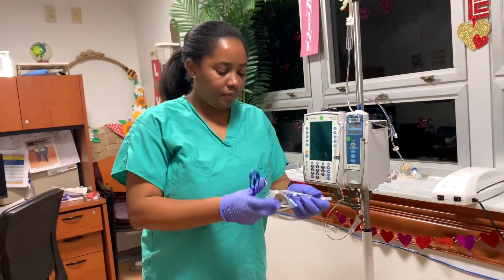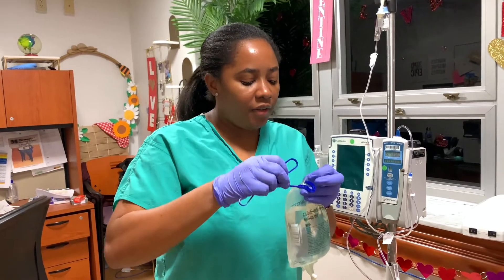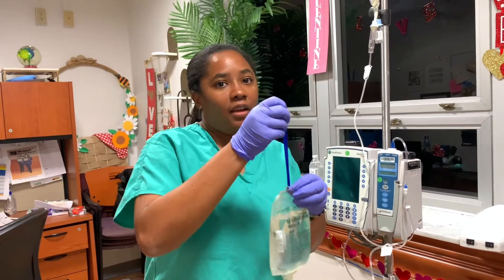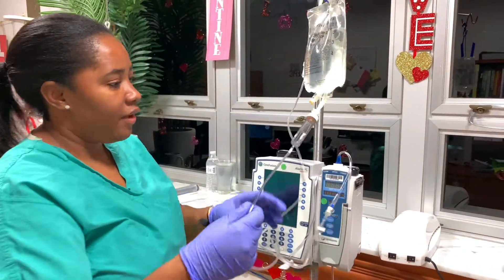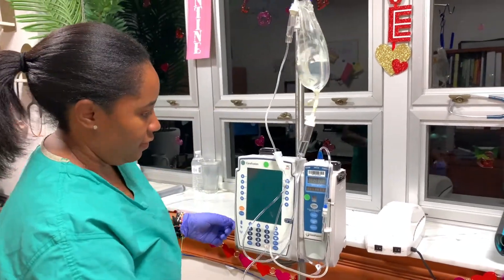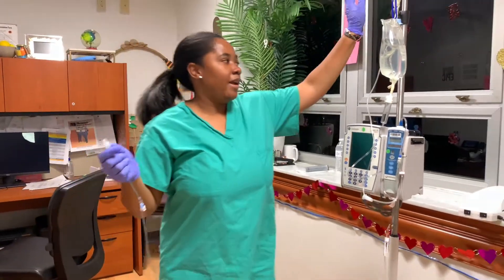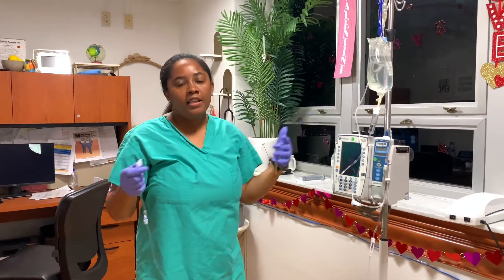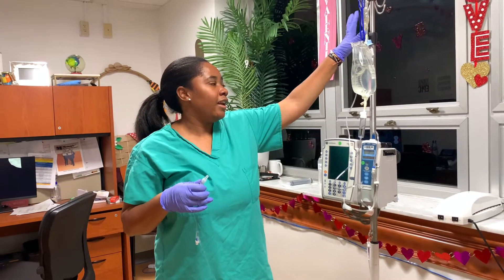Especially if you have a patient receiving both a secondary and a primary by gravity, the hook helps the secondary go first, and then the primary bag will then continue infusing. So after priming everything and before attaching to your patient, take the little hook and put it on the primary bag to make sure that one hangs lower. Once you start running the pump, open all the clamps and attach to your patient. So when everything starts infusing, it avoids any backfill toward the patient, and the antibiotic will go first before the primary. Just make sure you are programming the pump correctly — if doing it by gravity, naturally your secondary will go before the primary.